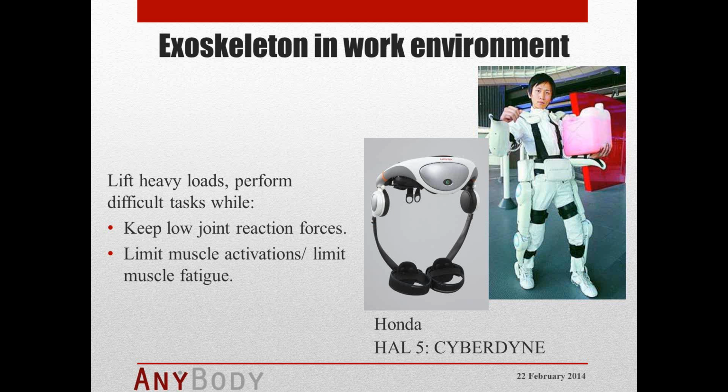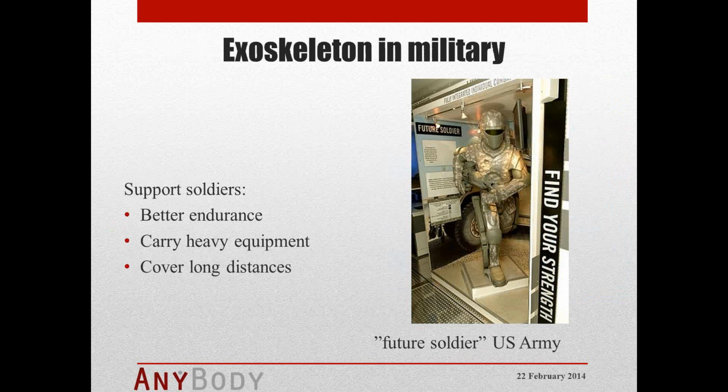On the other hand, if you need additional strength, there are other exoskeletons, like one developed by Honda, or HAL 5 from Cyberdyne. It's also a very famous one. So you can lift heavy loads or perform very difficult tasks without getting fatigued or tired. So you keep your joint reaction forces low and still lift heavy loads, and don't have excessive muscle activations while you do difficult tasks.